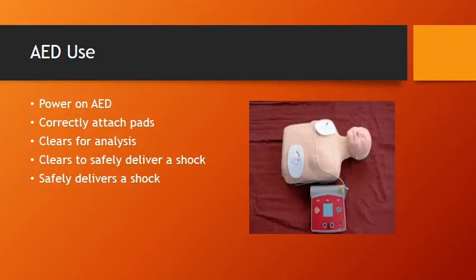We do not want to turn the AED off during CPR, and we resume our high quality chest compressions immediately after the shock is delivered. And that is what we need to do to administer the proper use of CPR and AED to an adult victim.